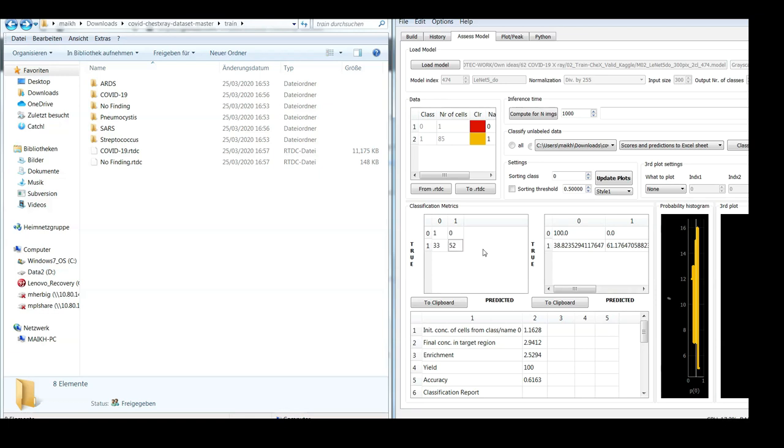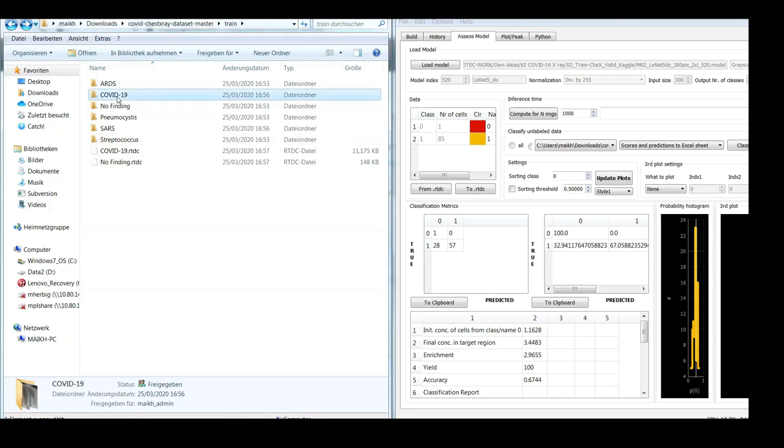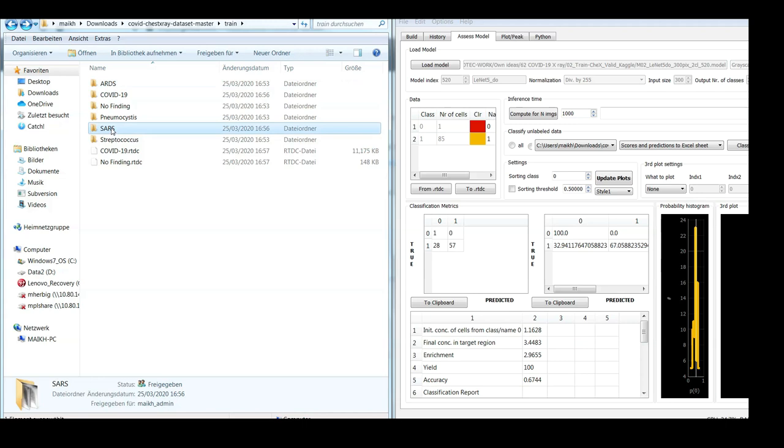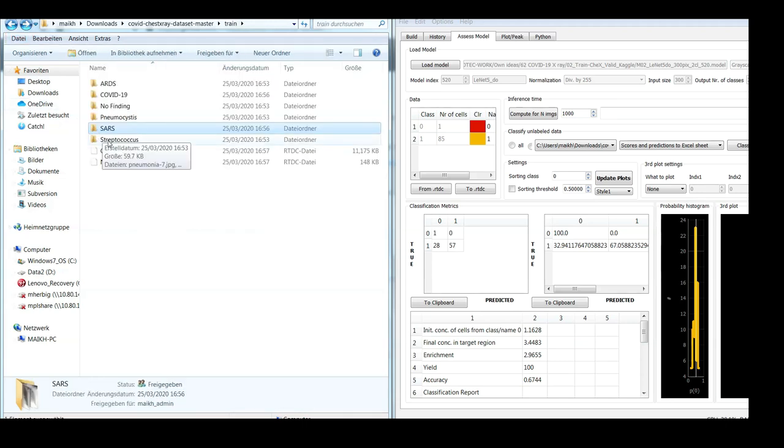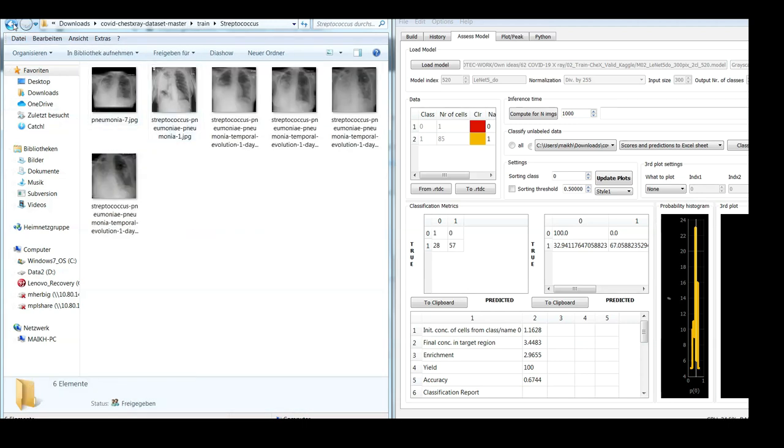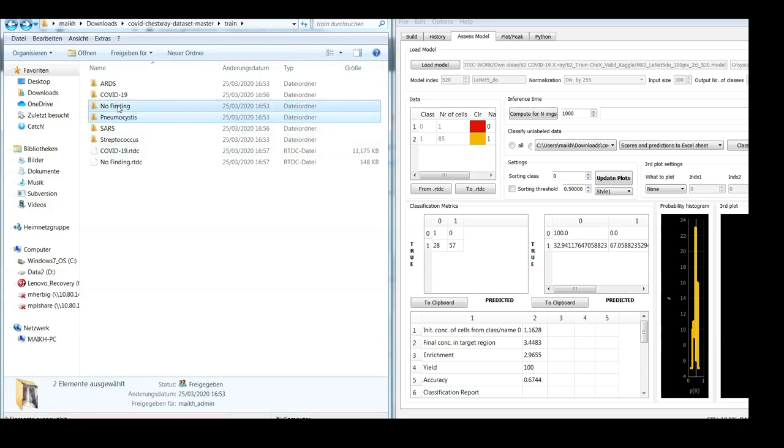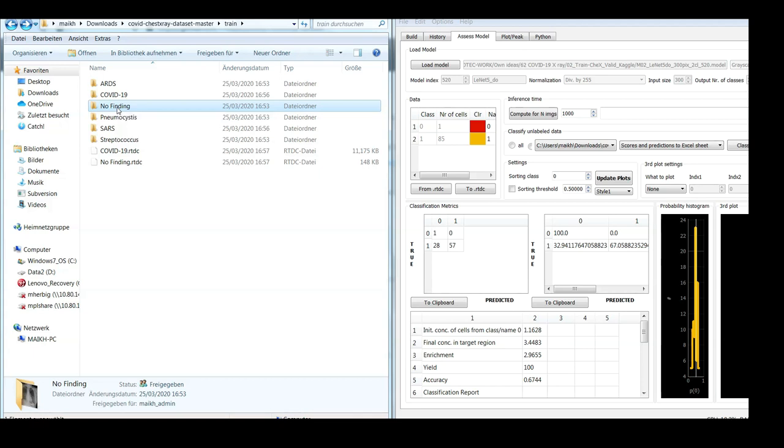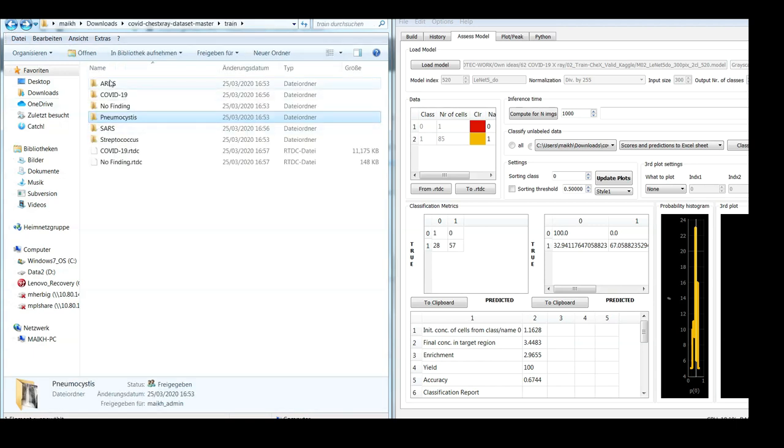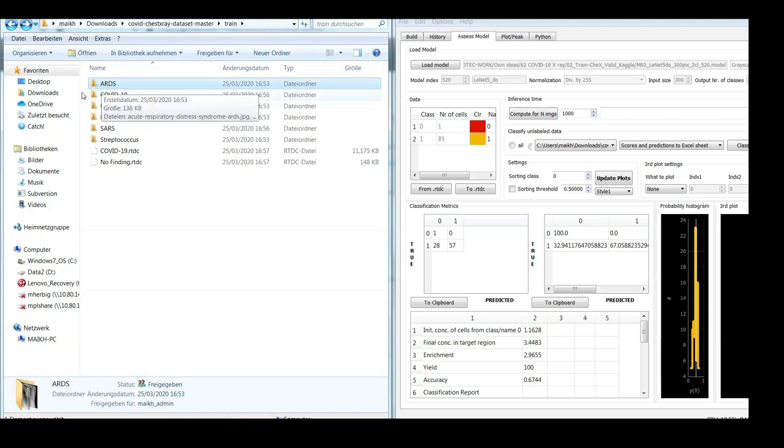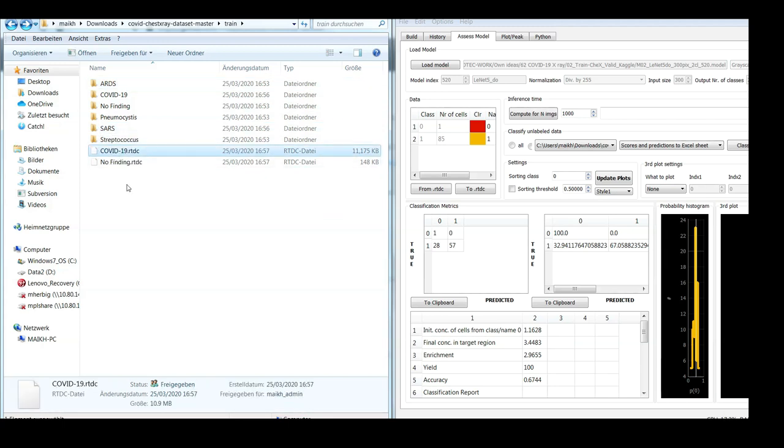Now I would like to optimize the model of index 520 to distinguish images from COVID-19 patients from patients that had another illness. That means I would like to pool images of ARDS patients and Streptococcus patients. I would like to leave out Pneumocystis and 'no finding' since 'no finding' means healthy, and there is also just one image. Therefore, again, I would like to pool images contained in this folder and try to train a model that is able to distinguish these images from images from COVID-19 patients.